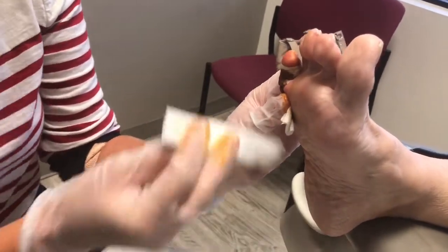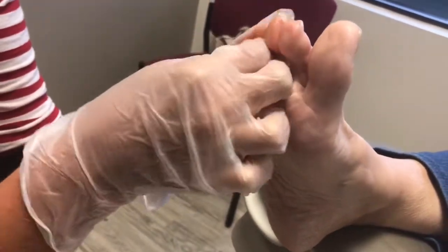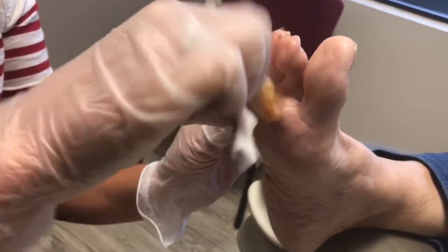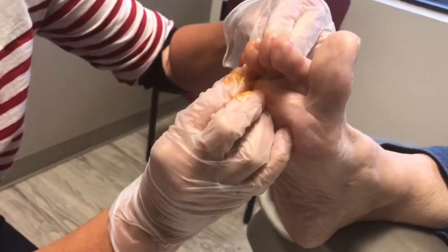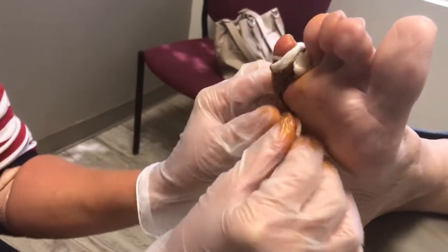I'm going to have another one look like this, because we really want to get this guy away from the fourth toe. I'll take another betadine, and then I'm just going to do another one overlapping to pull this one over. There we go. I like that. Look how pretty that is. Let's keep that right there.